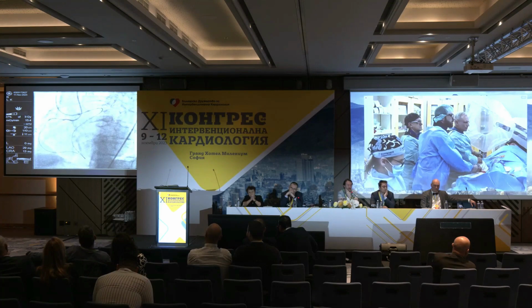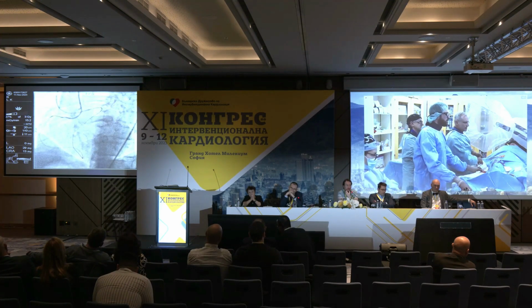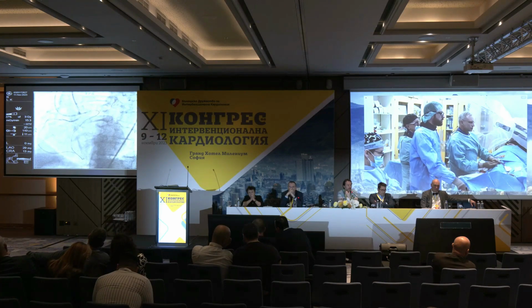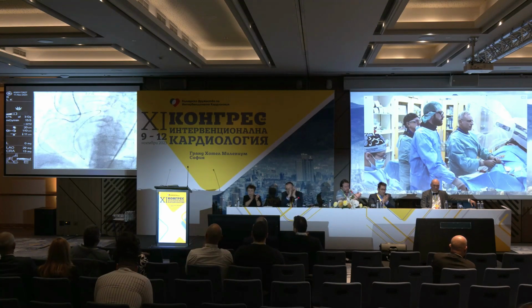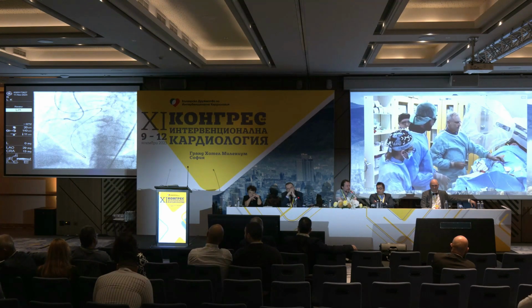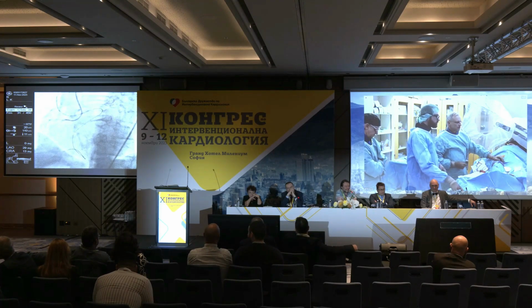What I don't want to do is put this microcatheter back. So let me see if I can work more on the guiding and see if I can just push it in. You have already created some space between two planes. So yeah, you will do it. This is just a matter of patience. It was a small movement. Yeah, give me a 2.5 balloon. Yeah, George, it was after giving contrast from antegrade. You created more fenestration, I think. It's a matter of time.